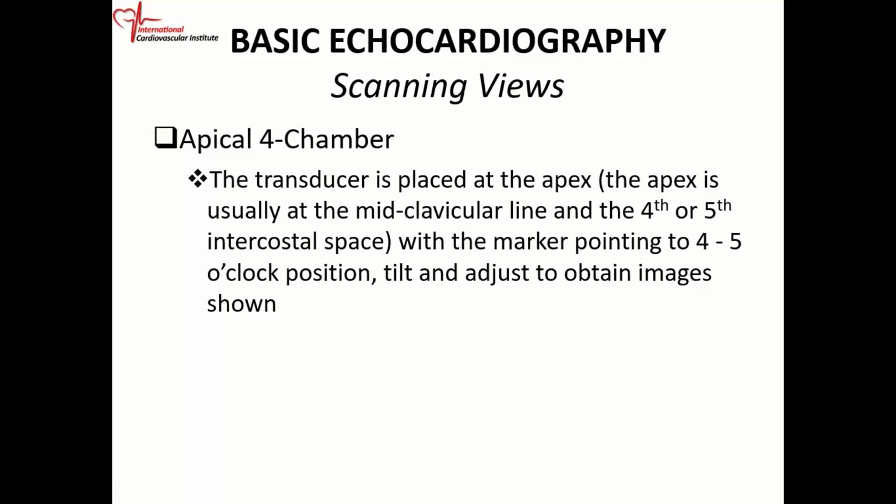All right, so once you finish your parasternal views, so that is the long axis and the short axis, you'll take up the transducer. Whenever we scan, we put gel on the transducer. We put gel because it's easy to move the transducer.